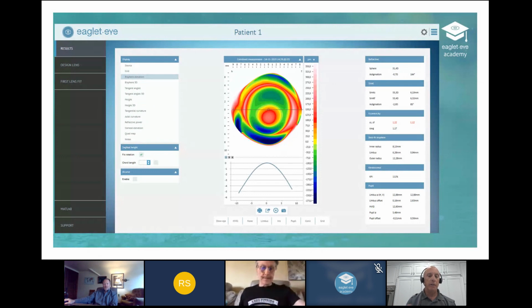It's going to tell me what lens to get out of the diagnostic kit, because if I think back to before my Eaglet, I would take a guess and look at this profile of the eye and say, all right, this looks pretty good, and put a first diagnostic on. Then I'd go, oh, it's way too flat or way too steep, and go to the next and maybe another one, and you're already wasting time and beating up the poor patient and all that.